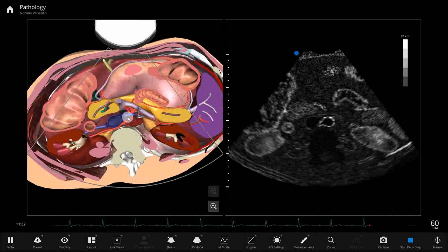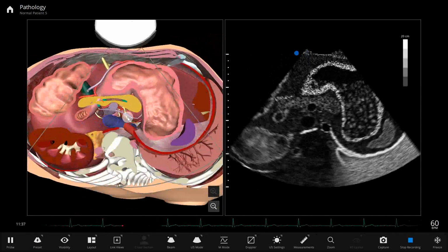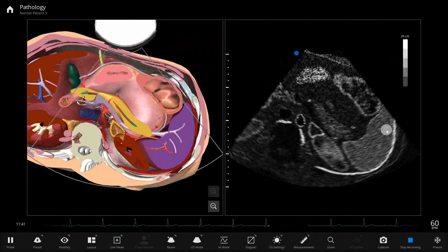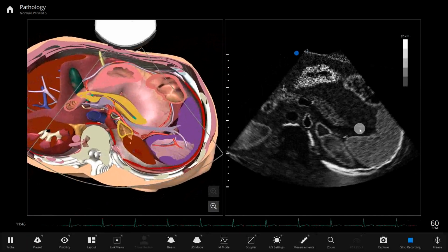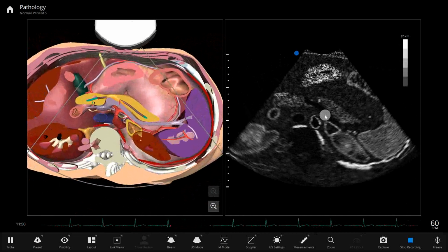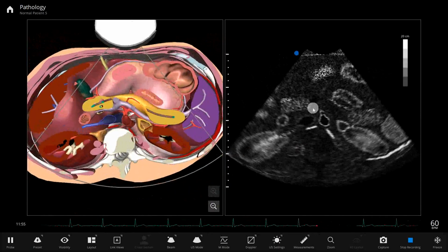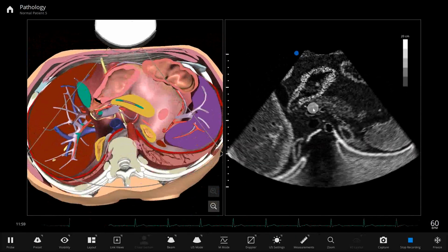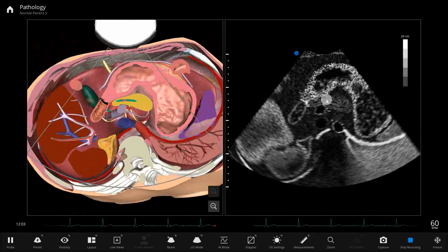Okay? Now, if we look at that portal venous system on ultrasound, okay, there's stomach, here's our spleen over here. Okay, we want to see that splenic vein. That's this dark area running posterior to the pancreas. Okay, it's going to run over to the pancreatic head. Let's get that pancreas very nice in the image. There we go. Okay, pancreas is right here.